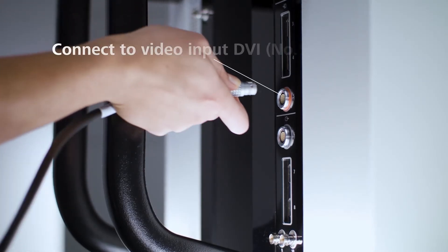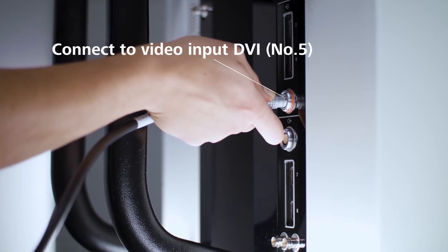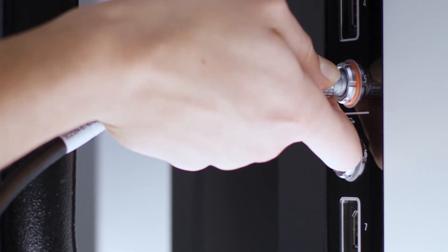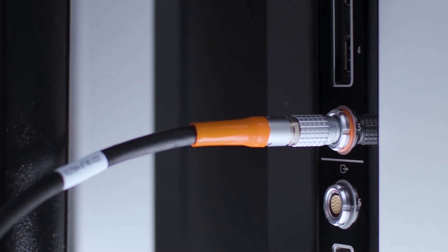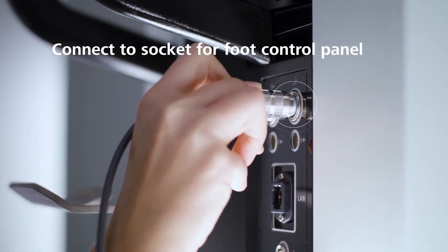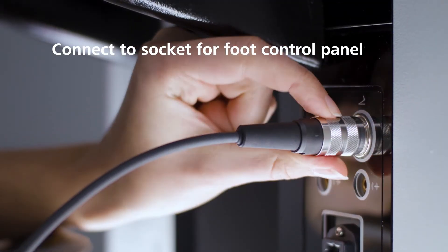Now plug the video cable into the DVI-Video input connection socket seated on the connection panel of the Zeiss Knievo 900. Plug the trigger cable into the connection socket for the foot control panel.